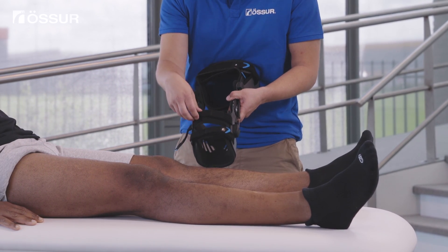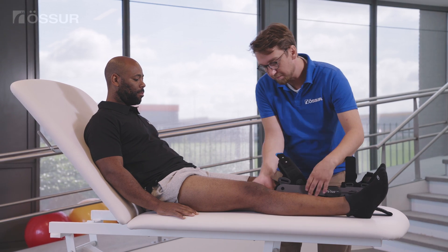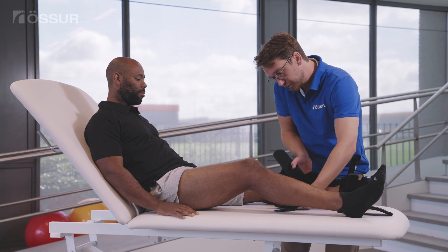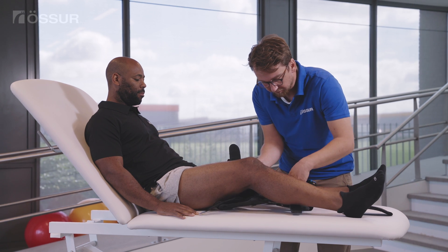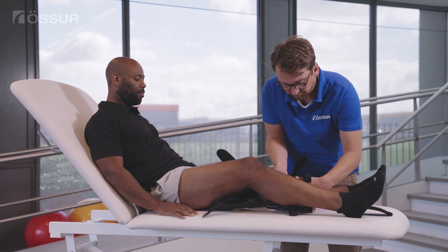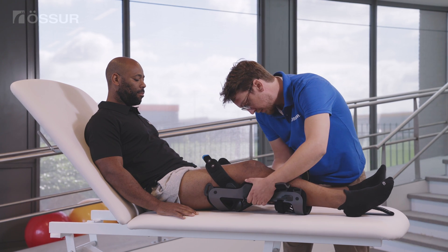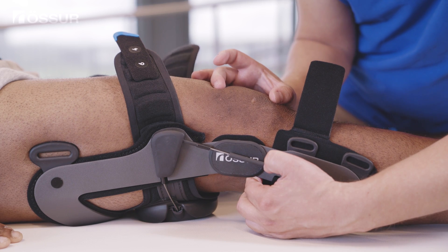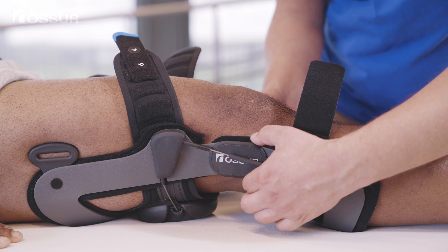Unfasten all straps. Slightly lift up the leg. Place the brace on the leg in full extension. Fasten the anti-migration strap and trim the strap if needed. Ensure the hinge center is located at the mid-patella line.